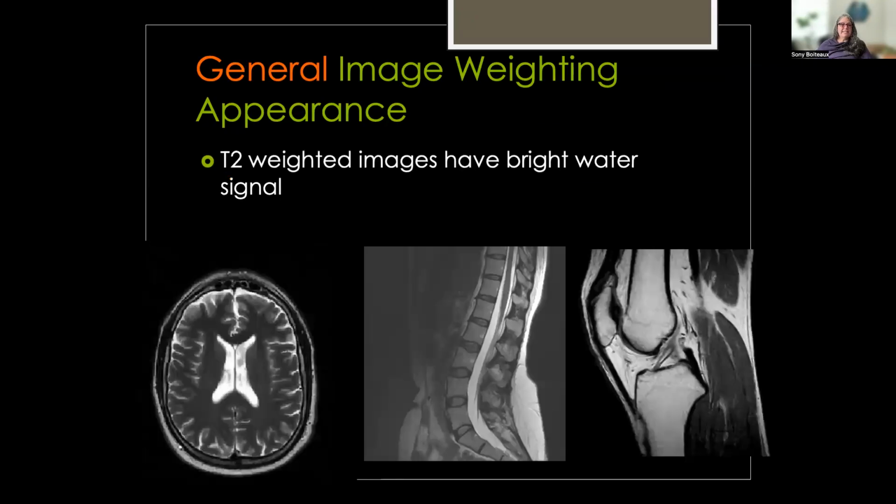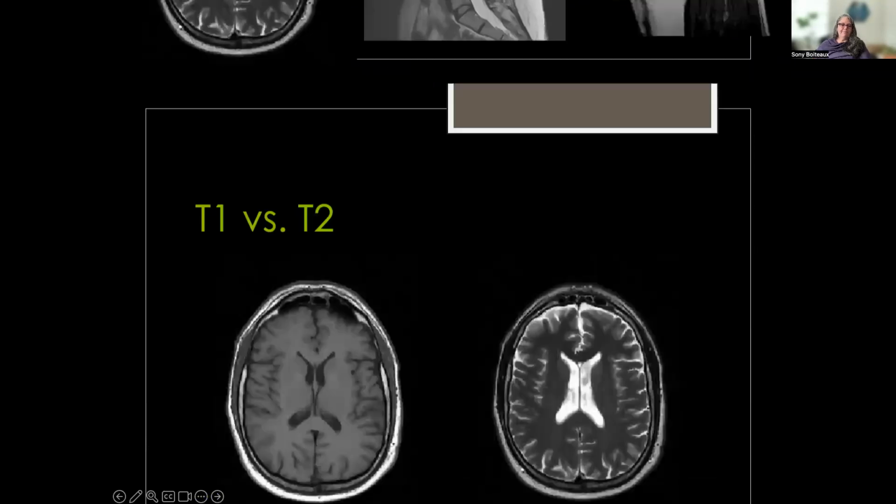And you can see that the T2 weighted images have a very different appearance. And so now we have very hyperintense signal, or high signal intensity, from the fluid. And again, we're seeing the CSF in the spinal canal and the ventricles. There's a partial tear of this anterior cruciate ligament here in the knee, which we see from the fluid collection there. This should be solid black like the posterior cruciate ligament. And because we're seeing that hyperintense signal there, we know there's a partial tear. It hasn't completely torn away from the bone there.